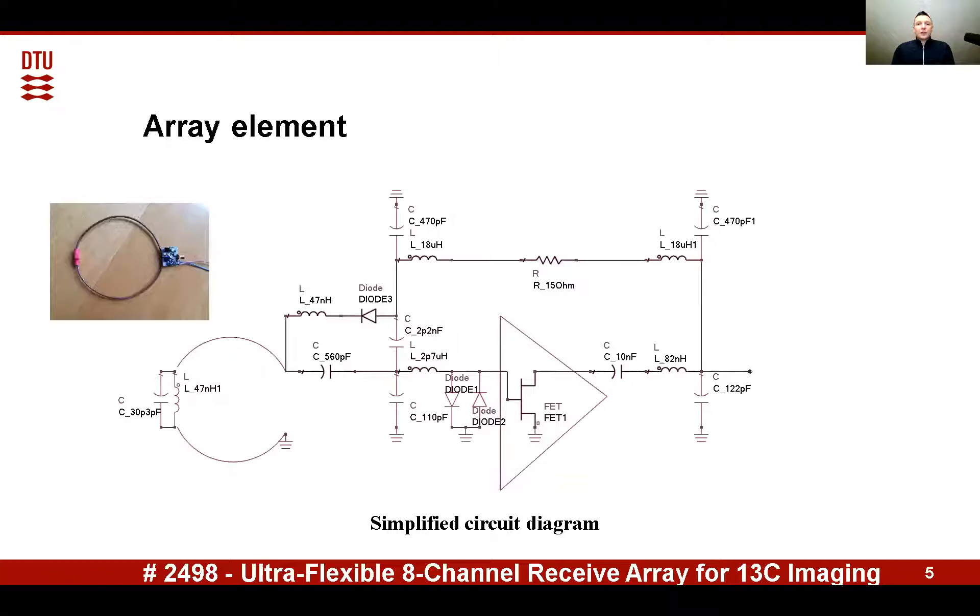Out of four solutions provided by these equations, a T-network is realized here. It consists of a 560 picofarad series capacitor, a 110 picofarad parallel capacitor, and a 2.7 microhenry series inductor. You can also see the output L-shaped matching network, which basically transforms the output impedance of the active device to 50 ohm.